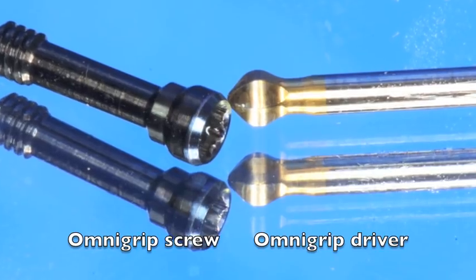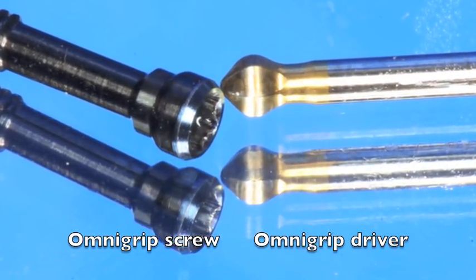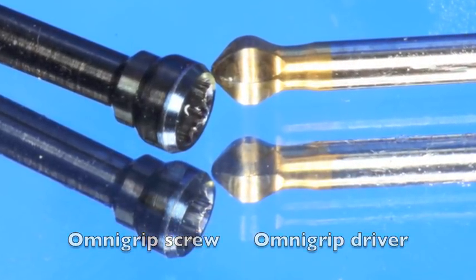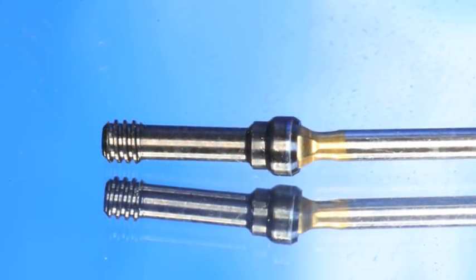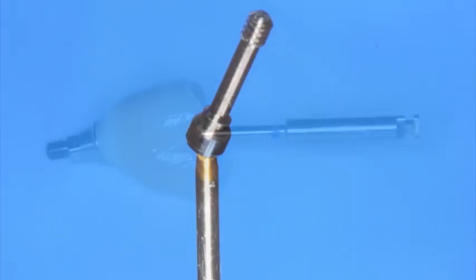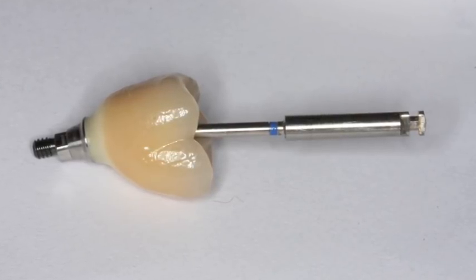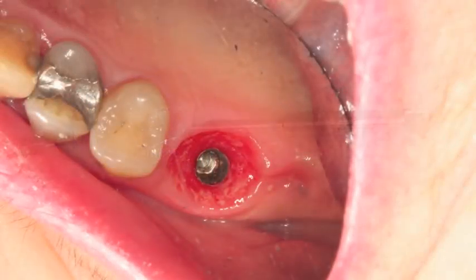The ASC channel uses an OmniGrip screw and to put this in place you use an OmniGrip driver. This is really quite neat because it's a system that carries the screw better than any other system I've seen. They click together and you can take this on different angles — you can rotate it sideways and still put the screw in up to 25 degrees. You can see the screw torquing on a different angle. The neat part is you can put it in the mouth and then turn sideways and start to tighten.